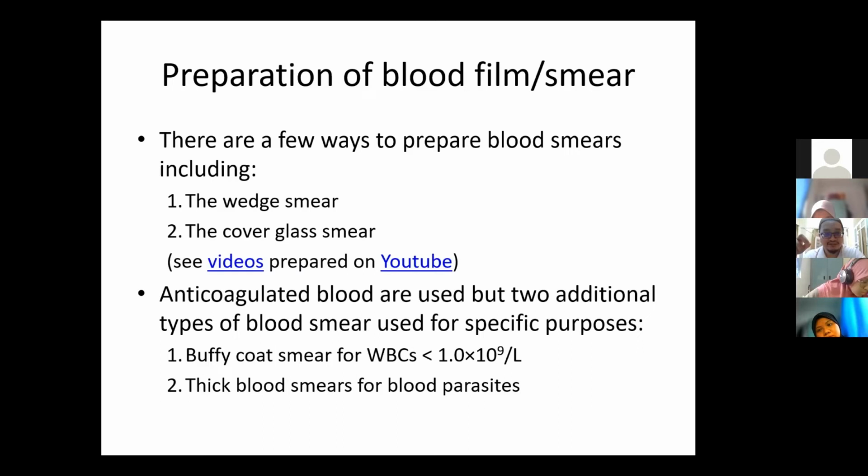But kalau yang pakai specialized cap tu pula, dia ada hole, and the blood will drop down due to gravity onto the slide and produce a very well-rounded, nice shape, nice amount of blood. Yang tu dia slow, sebab you need to wait, lepas tu you need to move to another slide. It is slower. It gives you a quality drop of blood, but the time is another problem.